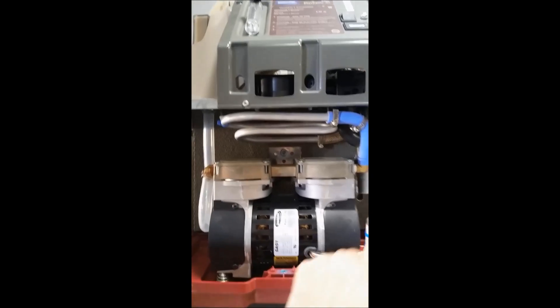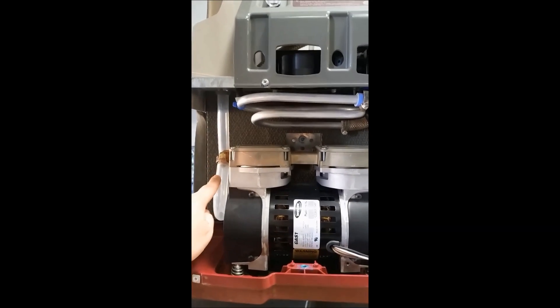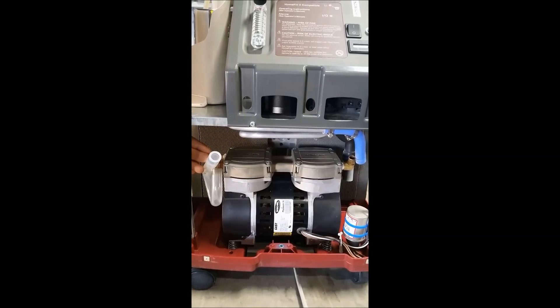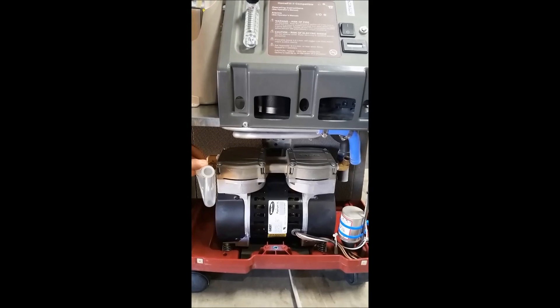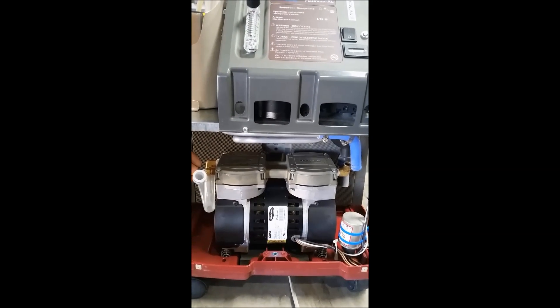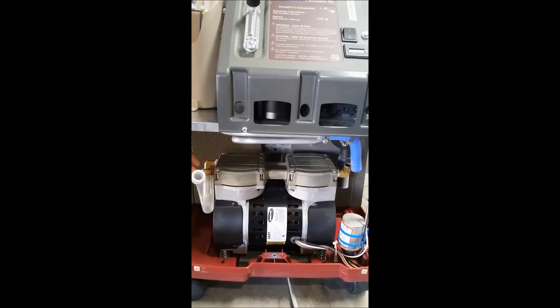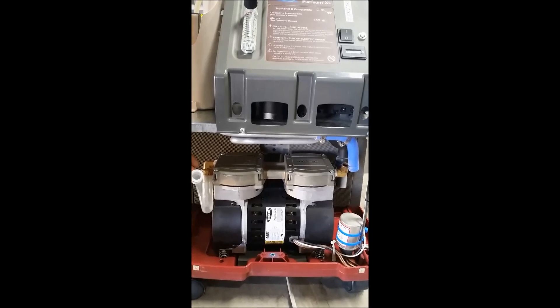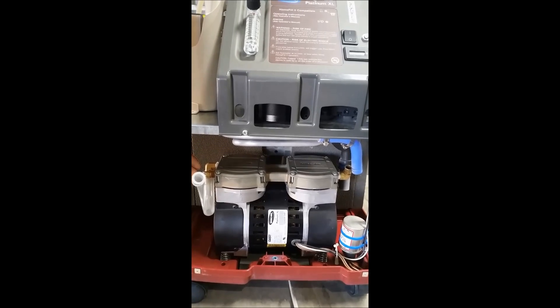Next we're going to remove this hose and this hose here so then we'll be ready. You may need to use a screwdriver with a flathead to help wiggle the hose off of the connector piece. That's okay — you're not going to damage the hose as long as you're not jabbing it.